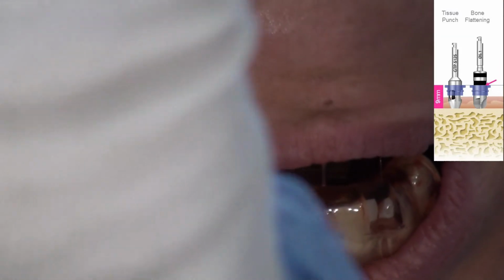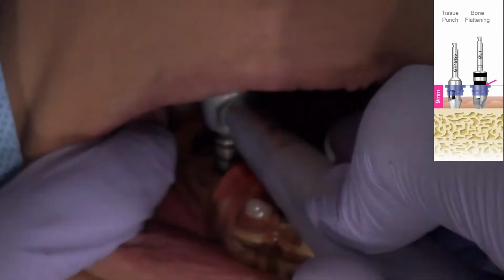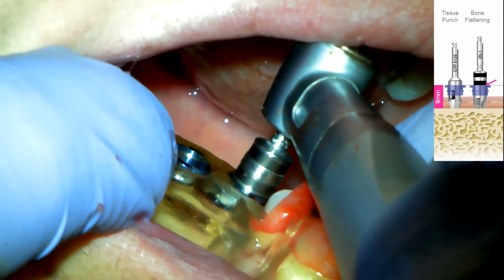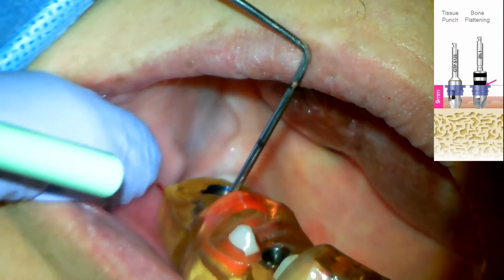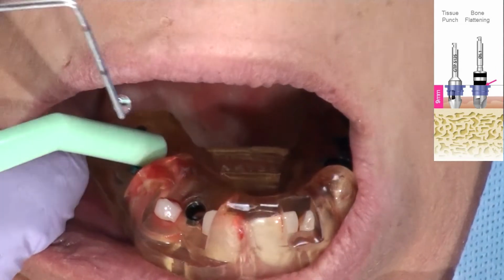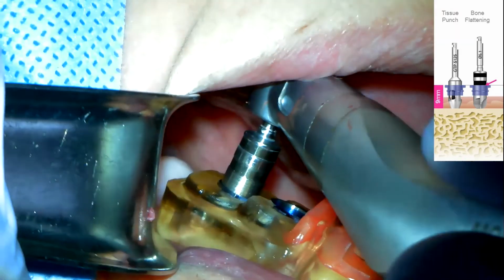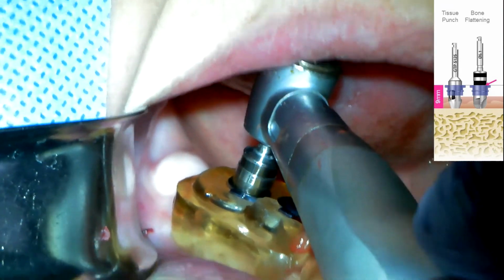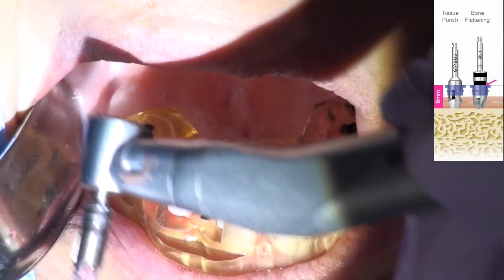Now I'm going to go ahead and use the bone flattening drill. Just to that first black line. That's plenty. A little bit of bone there. We're going to irrigate. Turn my way again. And again, just that first black line, pretty soft bone there. That looks good. A little bit of bone there. We could harvest that if we wanted.